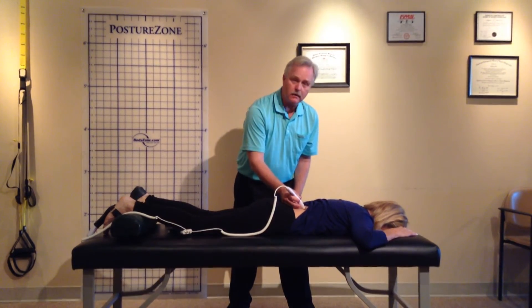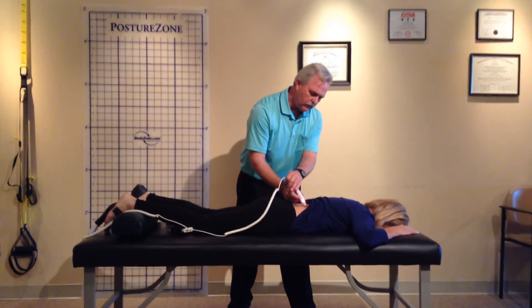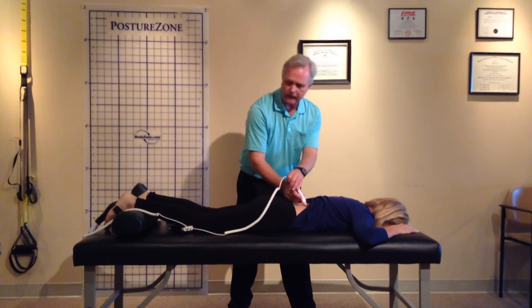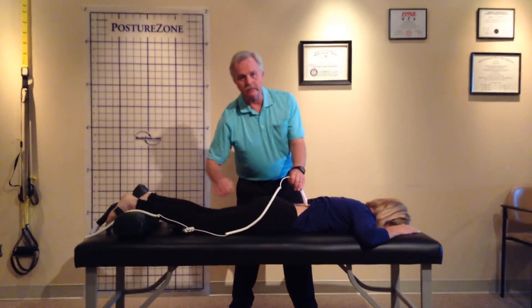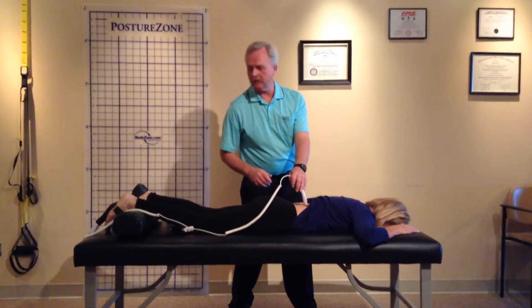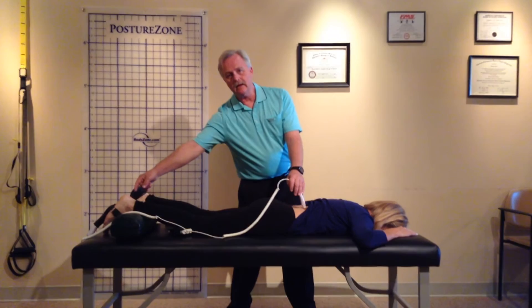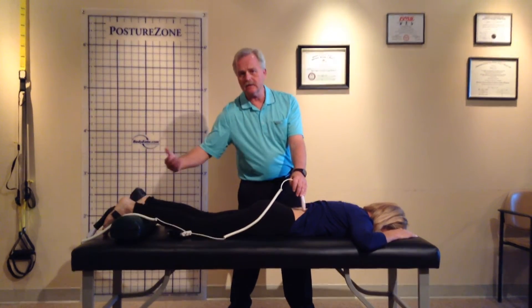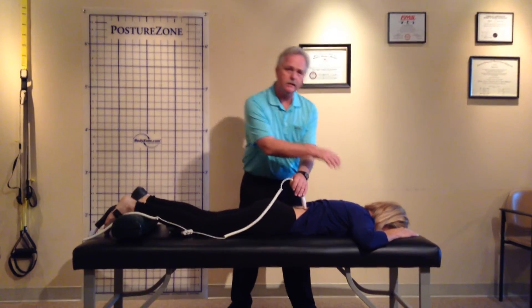Patients notice an almost immediate difference in many cases. You also get a little red light showing that it's on and active. It has a beeper, and you can shut that beeper off if you want it quiet during the treatment. As you can see, I'm working on this point up here, and the foot — whether it's plantar fasciitis or an injury of some sort — is still being actively treated while I'm working another area of the spine.